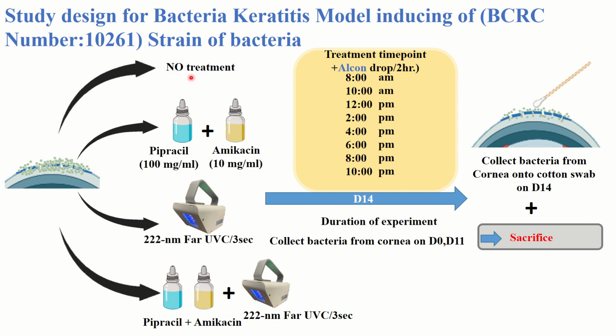This is the no treatment group. This is the piperacillin and amikacin group. These two are drugs used to kill the bacteria, and amikacin is used for severe cases. And this is the UVC for 3 seconds, 8 times a day. This is the treatment time point, 8 times a day. The duration of this whole study is around 14 days.